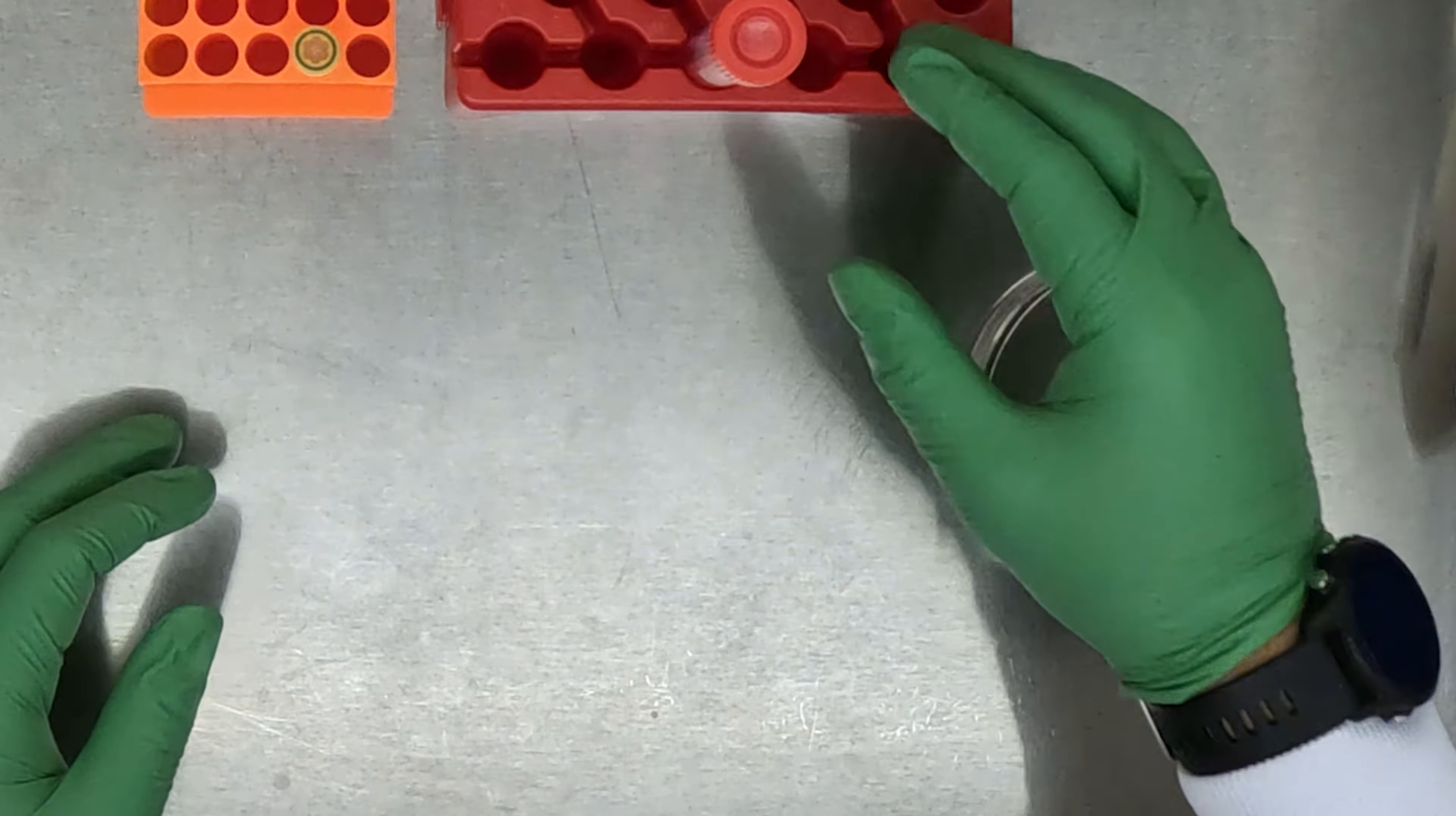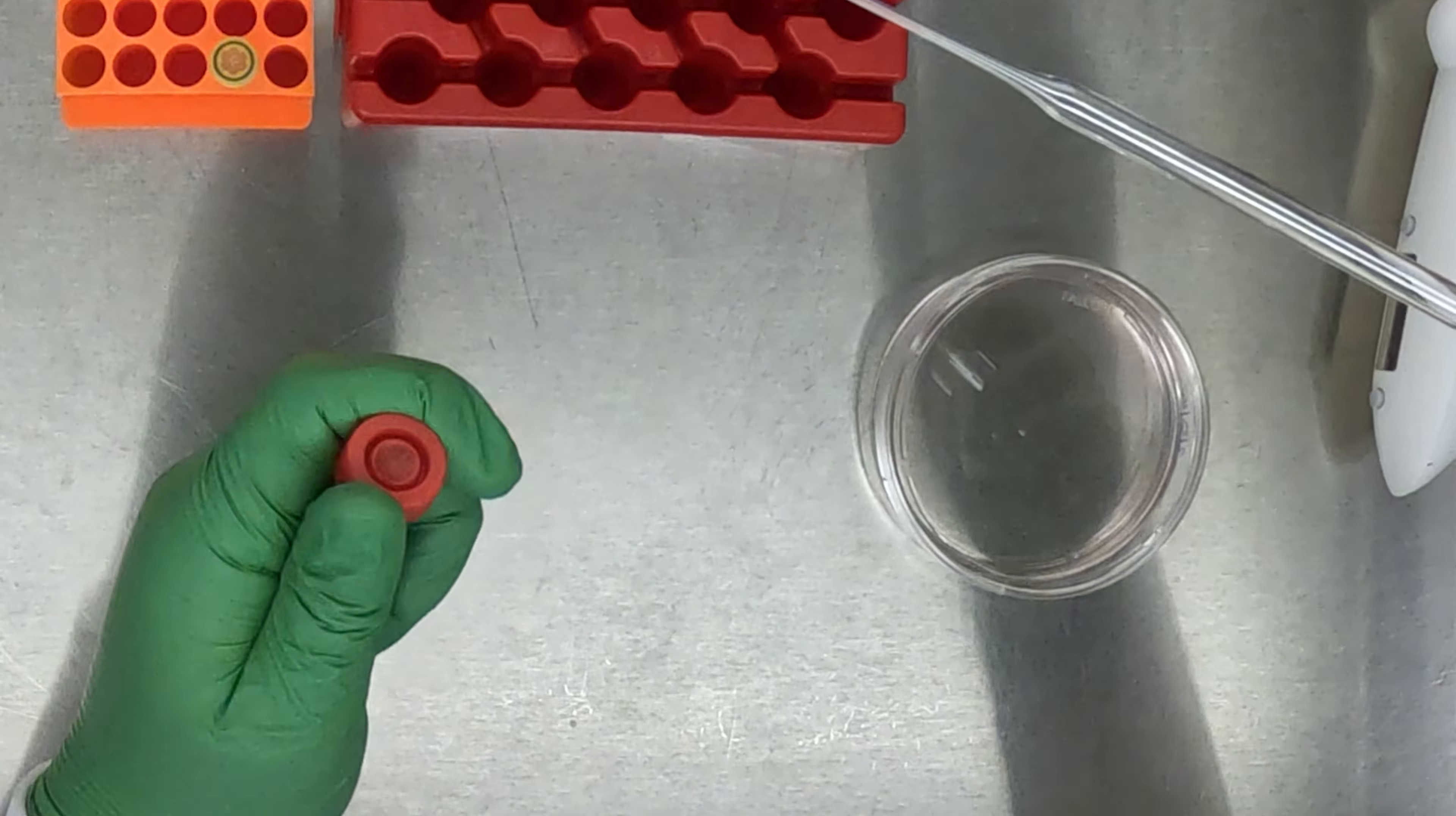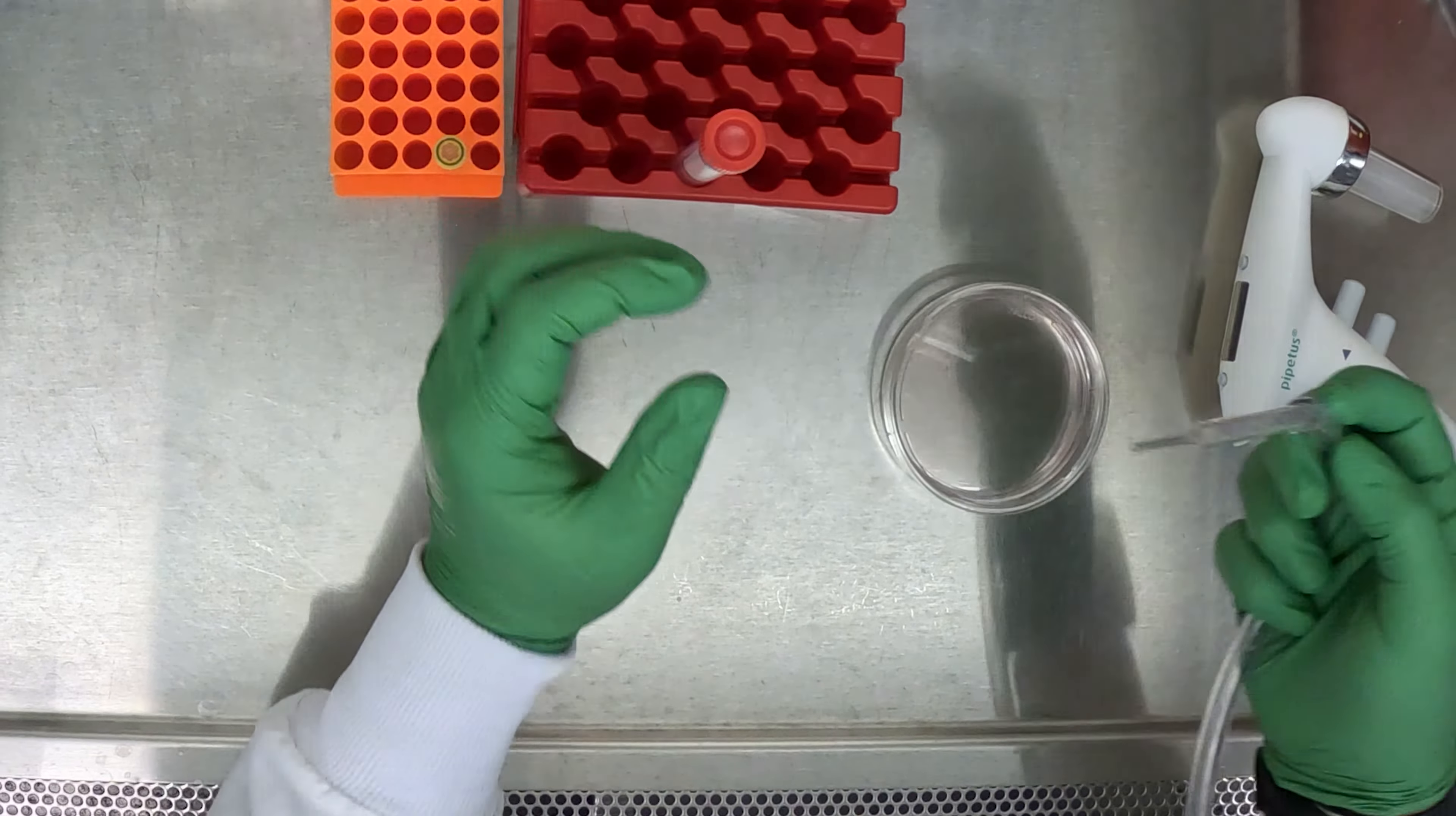Now that we've prepared our recovery plate, let's return back to our conical with our cells. Let's gently aspirate all of the supernatant off of the cells, being extra careful to not disturb the pellet at the bottom.